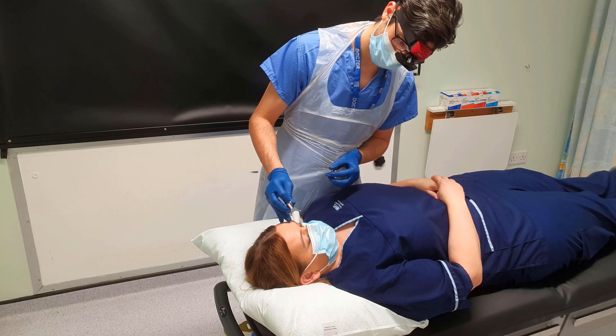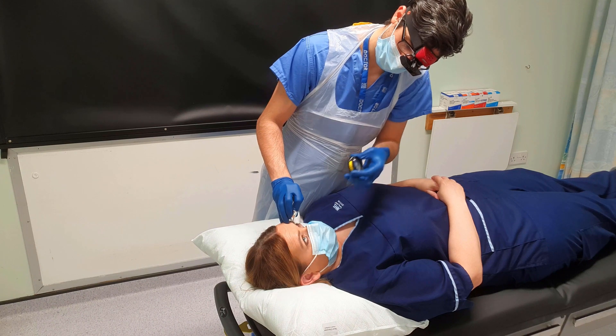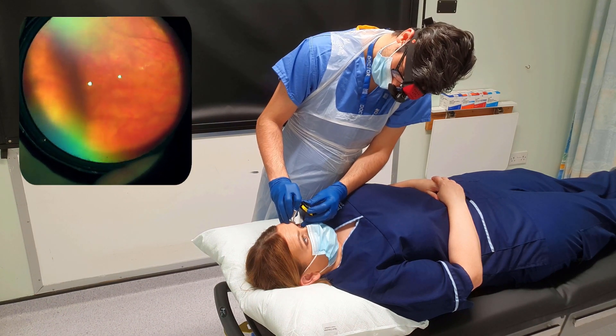With scleral indentation, the BIO can allow visualisation of the far periphery of the retina. This technique brings the anterior retina into view. It can be helpful to view the ora serrata and look for peripheral retinal pathology such as anterior retinal tears that would otherwise not be visible on a regular examination.